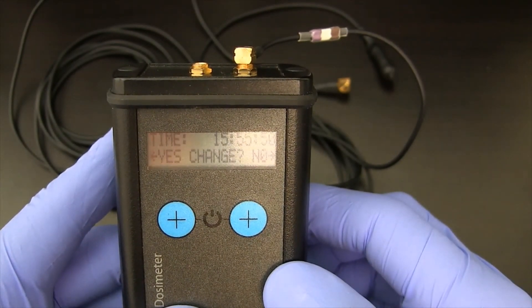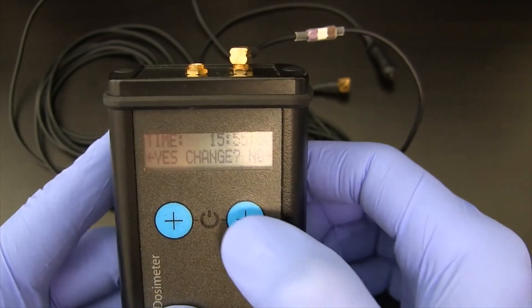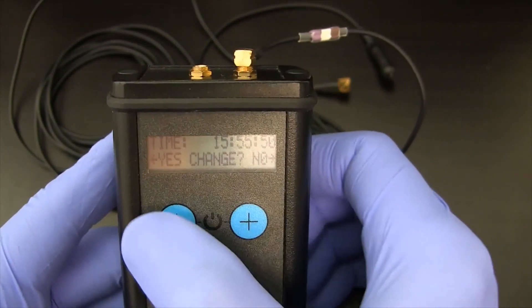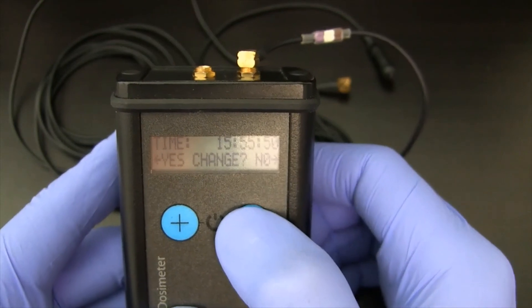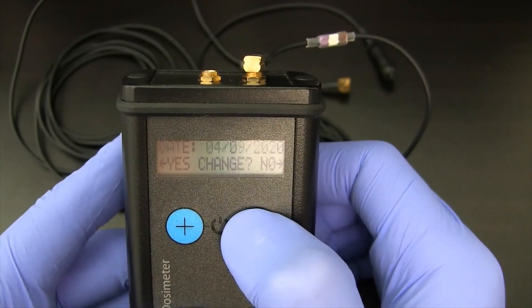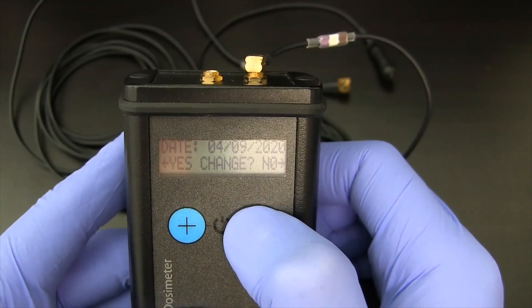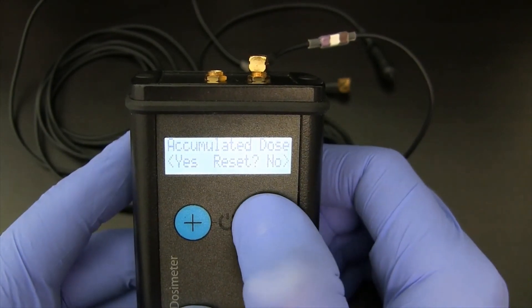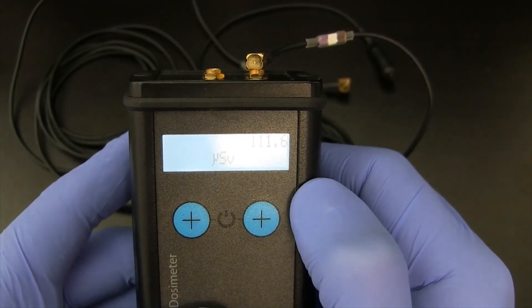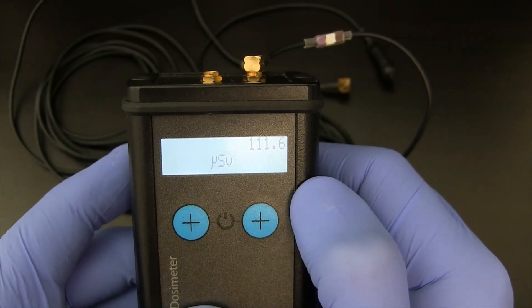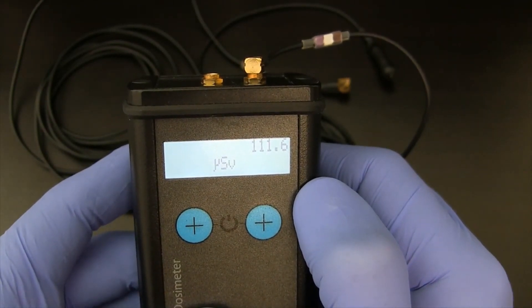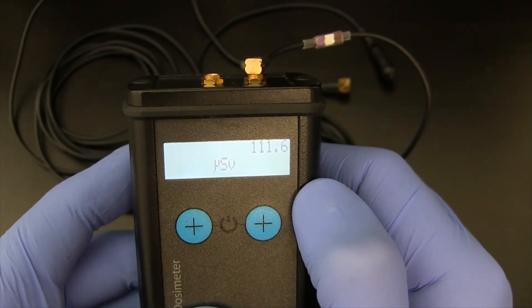So we're going to go and add a probe back onto the unit. And we're going to actually turn it back on. You can see the CAL. Whether or not we want to change the date and time, we don't. If we did, we'd just select yes and it would cycle through each of the date-time sections. We're not going to reset the accumulated dose. And now because I only have one detector, you'll see just that side populated with the accumulated dose.